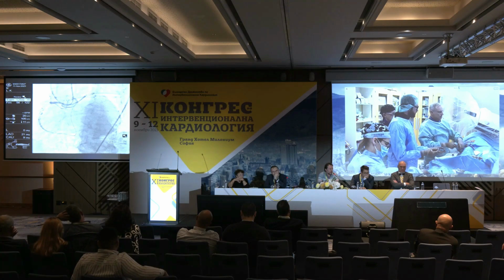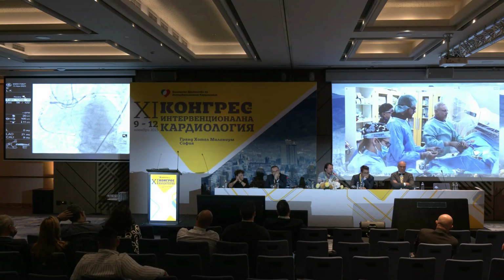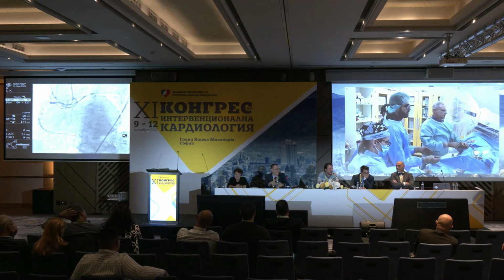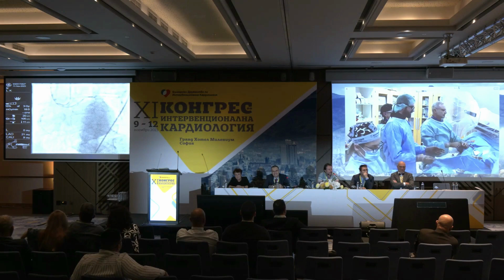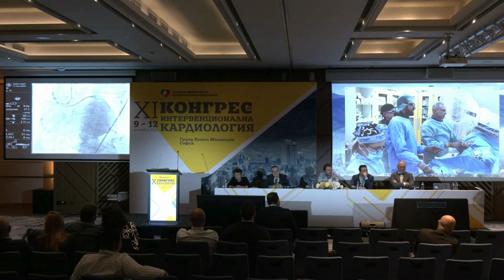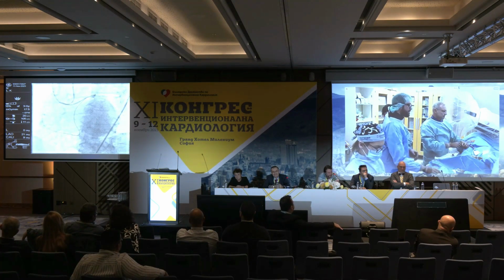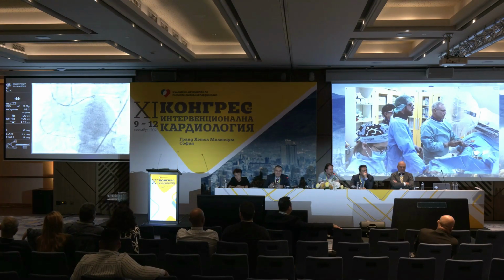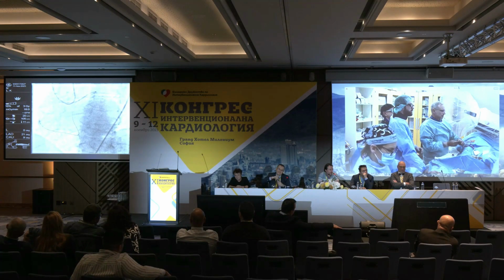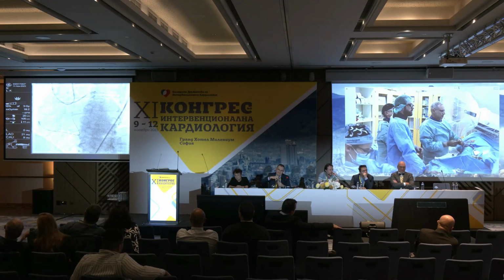So you have a lot of collaterals, and you're George Tsianos, so this is a relevantly good case and good example for us here. So we want to learn from you. Thank you, you made a very nice comment, because here, what he essentially said is that we have vessel ambiguity. So we don't really know where the occlusion is and what is the real track of this vessel.